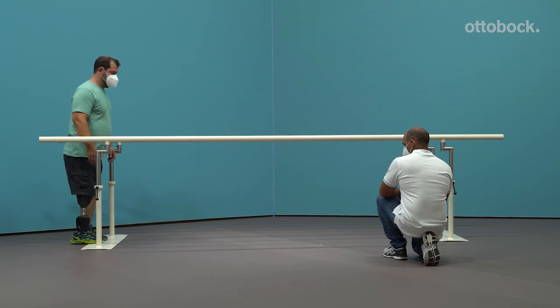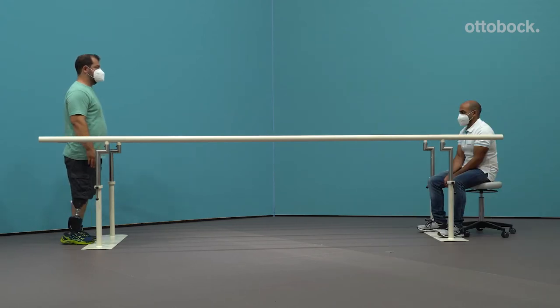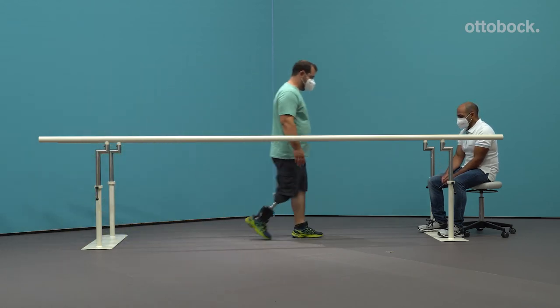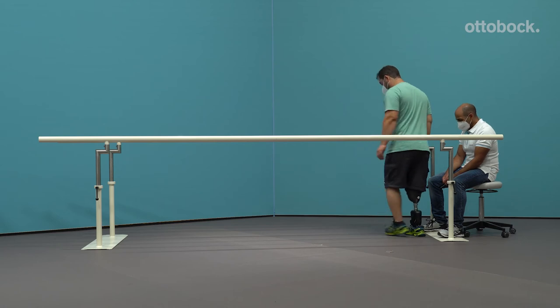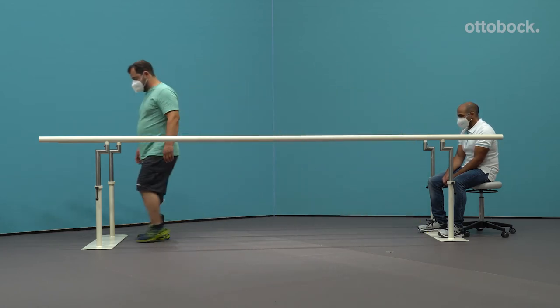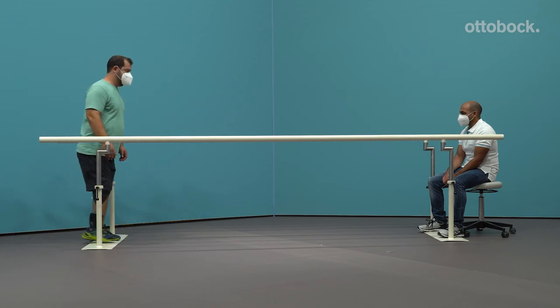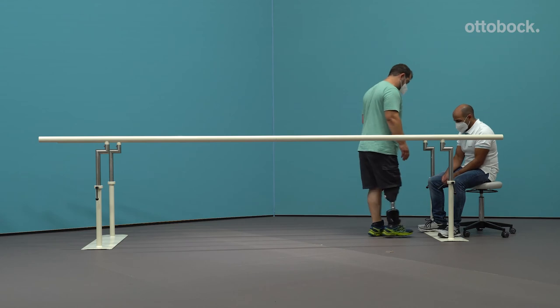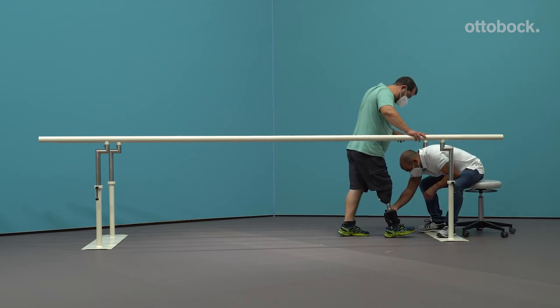Once alignment in the sagittal plane is complete, please examine the coronal plane. Is there an excessive varus moment during load transfer? If yes, move the prosthetic foot in the lateral direction. Note: adjust the external rotation so that the foot's inside edge of the shoe is parallel to the line of progression.